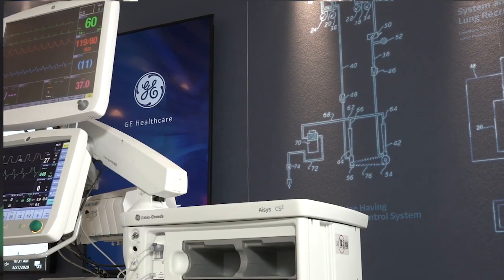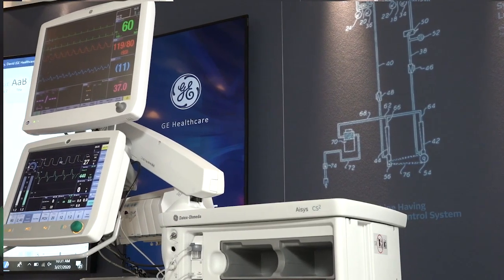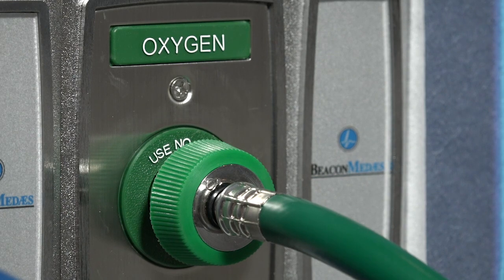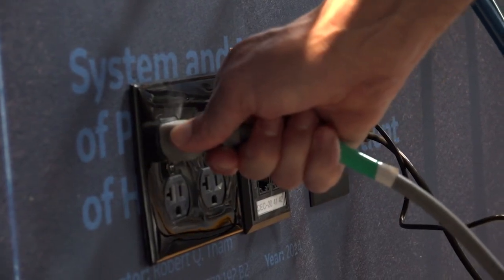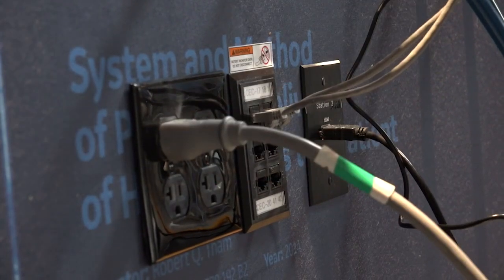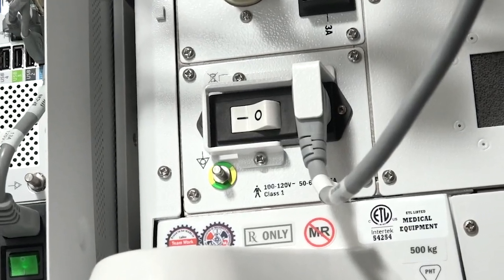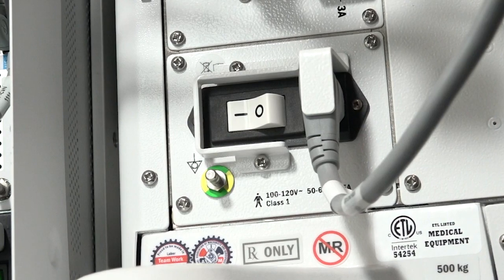For the ACES CS2 and ACES, connect the gas supply hoses to the wall gas source or turn on the gas cylinders. Plug the power cord into an electrical outlet. Make sure the system circuit breaker located in the lower back is switched in the on position.